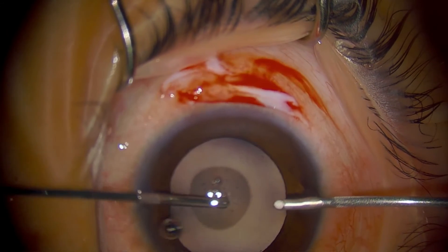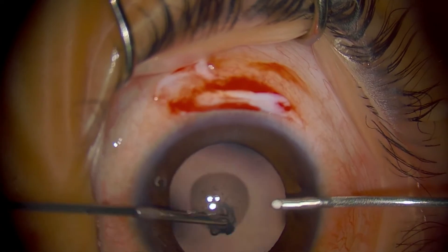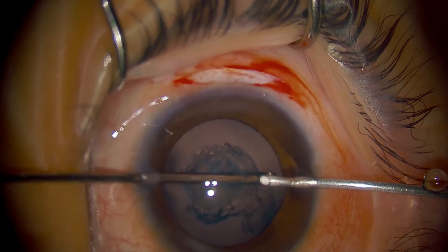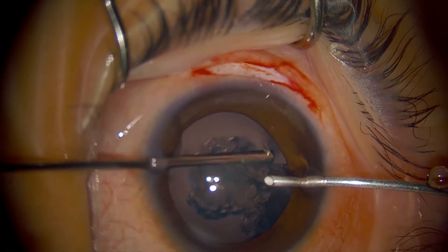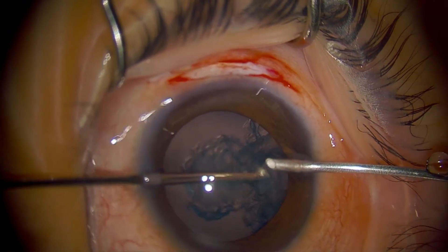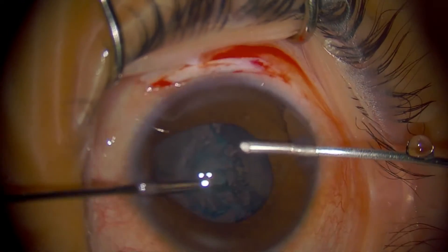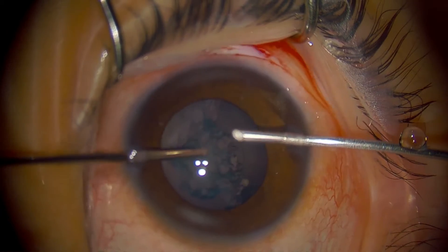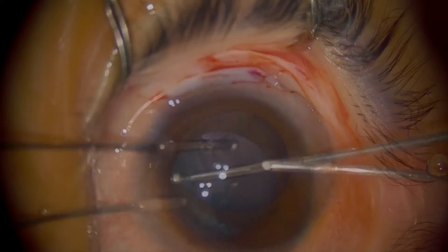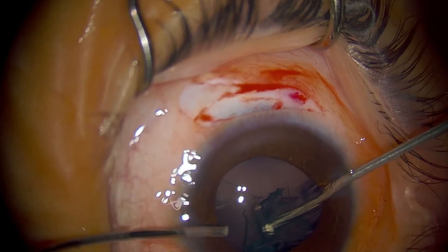Here's the vitrector — it's cutting like this. We're cutting a hole in the capsule already. That's a pretty good size. Now I'm going to turn the cutter off and just use the IA mode — now I'm just sucking out the lens. Children's lenses are very soft. Let's try to strip cortex by going side to side and peeling it off. I'm going to take the nuclei now. Now I have access to the other half of the lens. This two-port technique really allows you to get in there.